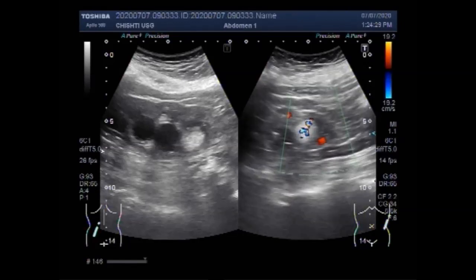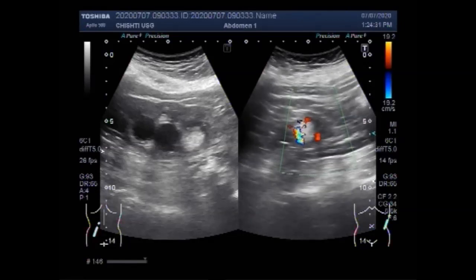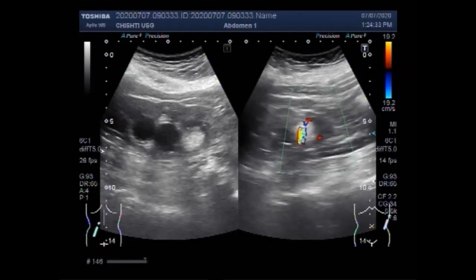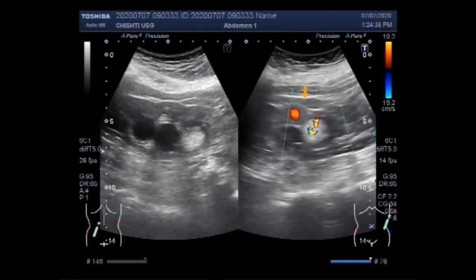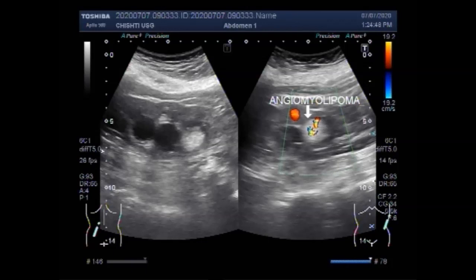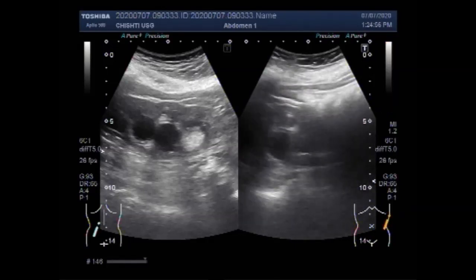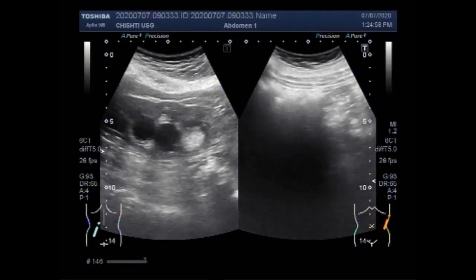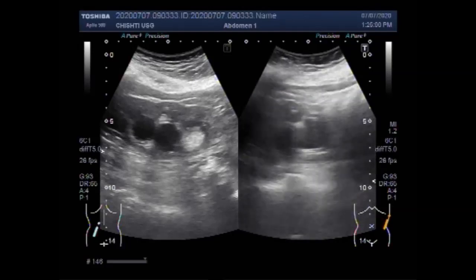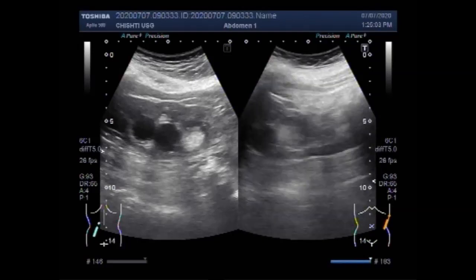Angiomyolipomas are the most frequent benign renal tumor, with a prevalence varying between 0.2% and 0.6% and a strong female predilection. They occur as sporadic isolated entities in 80% of cases. You can see some blood flow, which is usually mostly unusual.